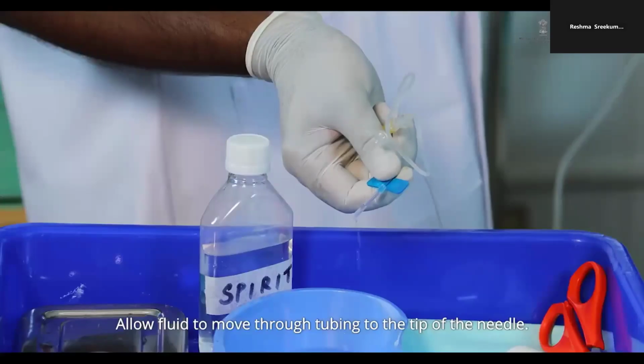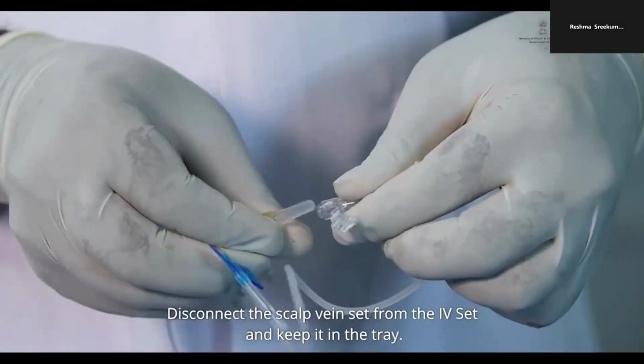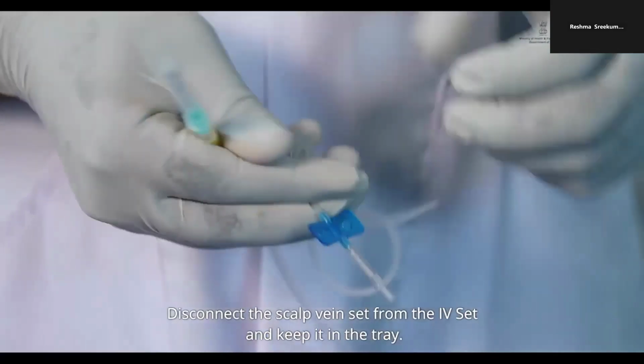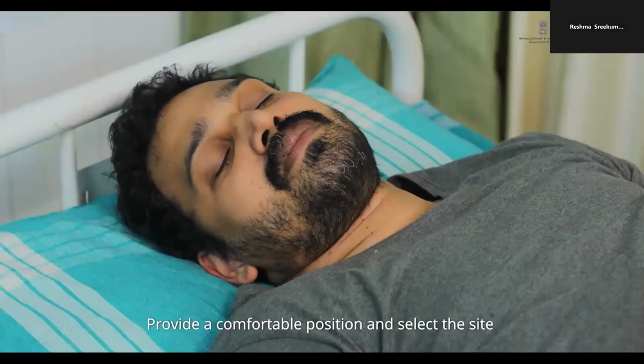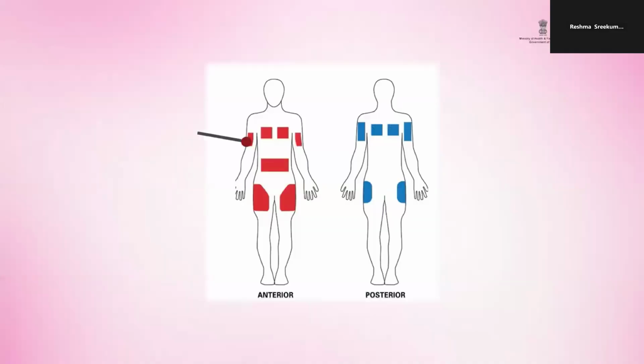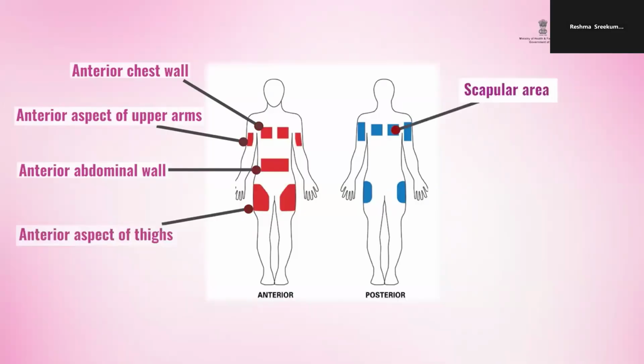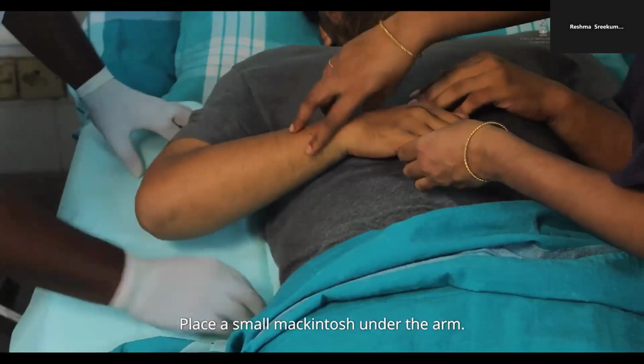Allow fluid to move through the tubing to the tip of the needle. Disconnect the scalp vein set from the IV set and keep it in the tray. Provide a comfortable position and select the side, which are anterior aspect of upper arms, anterior chest wall, anterior abdominal wall, anterior aspect of thighs and scapular area. Place a small Macintosh under the arm.